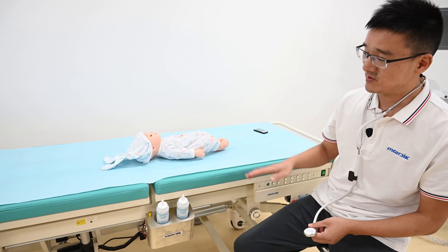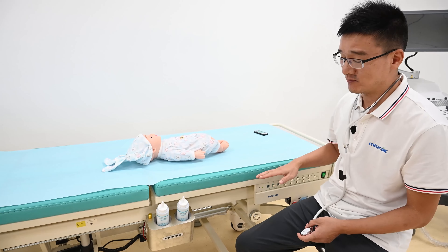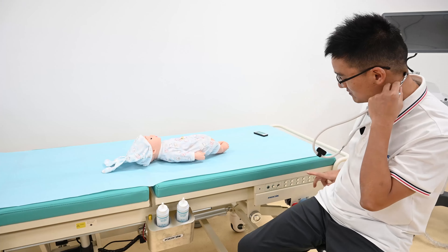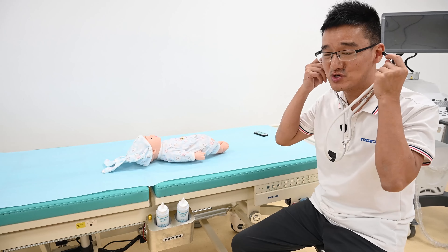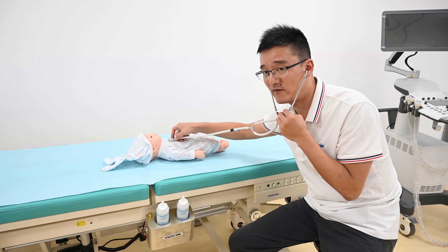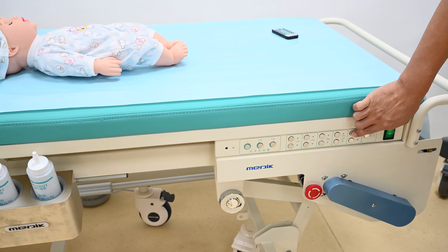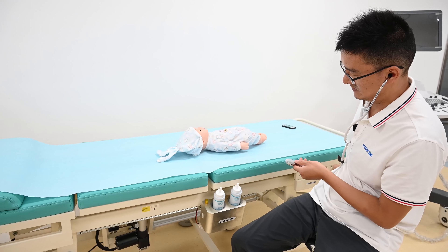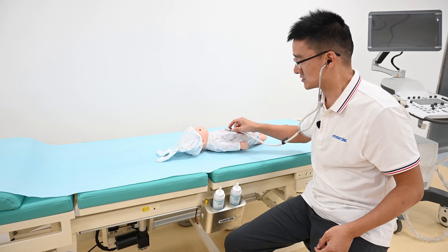The fourth special function for this table is the horizontal sliding function. When the doctor doesn't want to move their body, they just do the diagnosis by pushing the button to adjust the position of the patient. Let me show you — if it is too far for the doctor, the patient's body can move closer to the doctor's area.